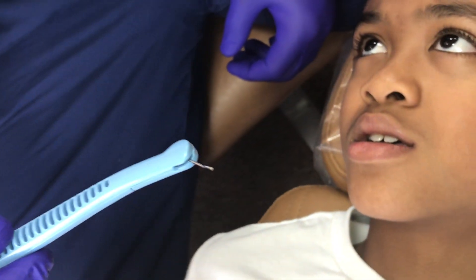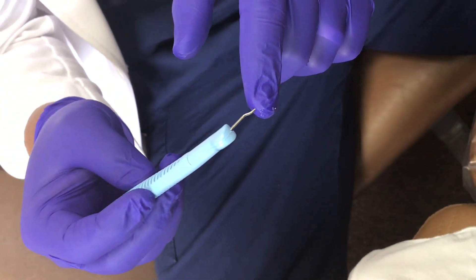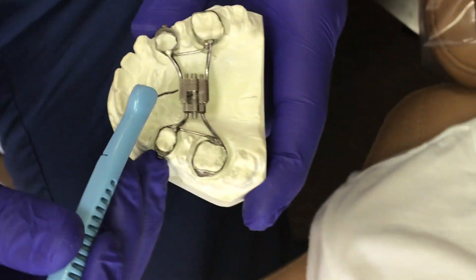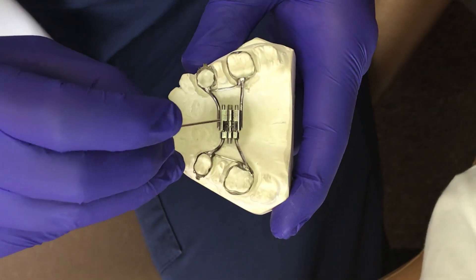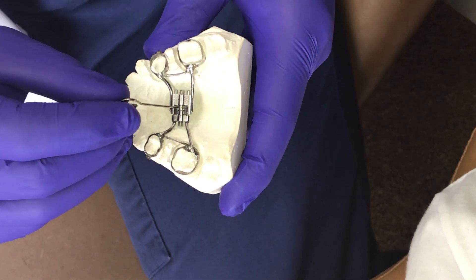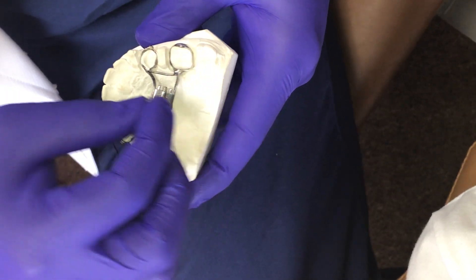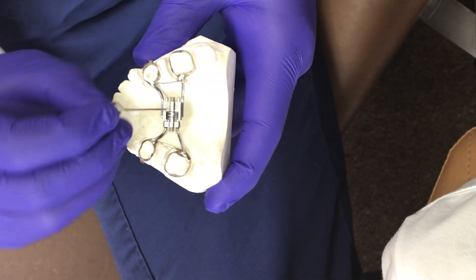This is the key, and this rod is what's going to fit into the keyhole. This model of the expander can show you how — right here at the front you can see the front teeth; this would be the front of the expander. There's a little hole right there, and what you're going to do is spin it back towards the back of the mouth until you see the next hole.